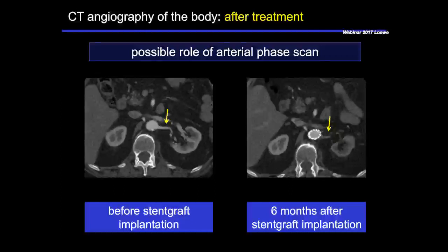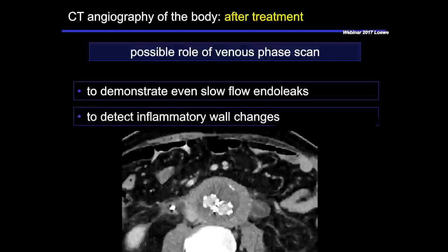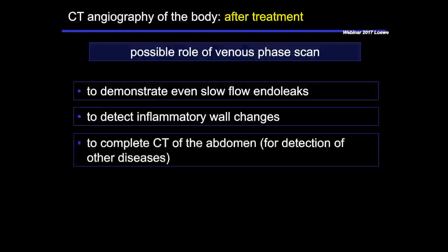And of course, the venous phase scan is important as it allows for the assessment of even slow flow endoleaks and to directly demonstrate even inflammatory processes. And of course, to look even for non-vascular diseases, like a screening examination.